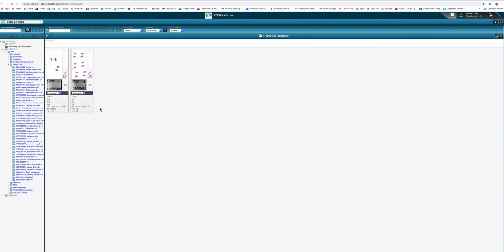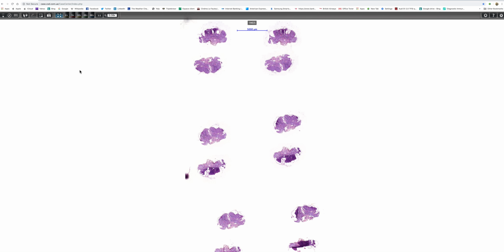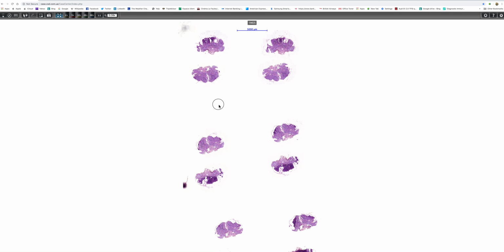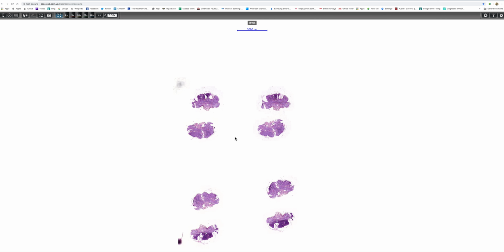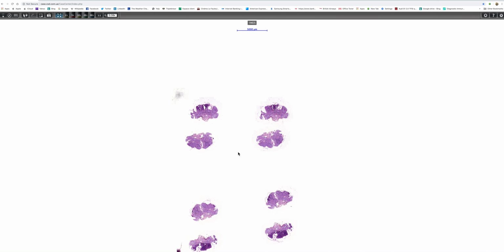In this video, I'm going to show you two cases of classical Spitz nevus. These have been kindly shared with me by Dr. Antonina Kalmykova of CSD Healthcare in Kyiv. They're both lovely examples, and I think it would be useful to look at these carefully and form some baseline ideas as to how we approach Spitzoid lesions. I'll talk about atypical Spitz nevus or atypical Spitz tumor and Spitzoid melanoma in a different video.